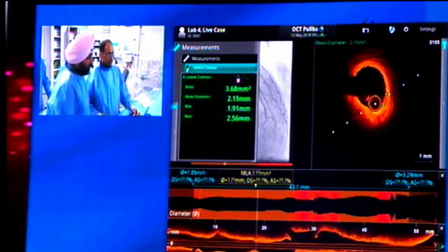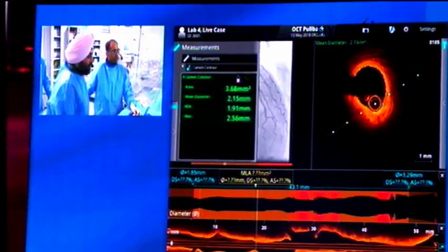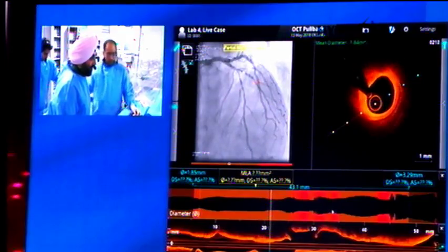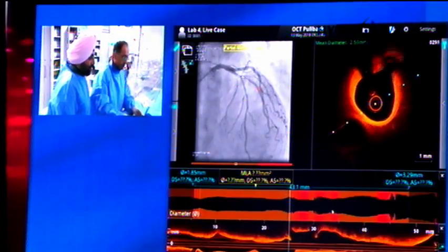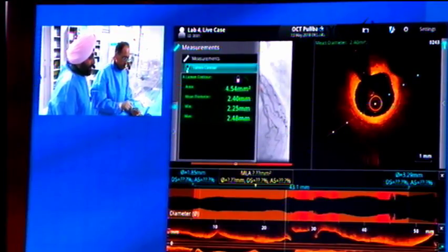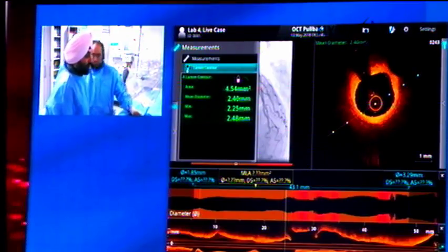So on the side branch, I don't think that's going to be anatomically significant. So I think the decision here not to proceed with a two-stent or bifurcation strategy was valid. And if we just keep coming here, we're coming up to the bifurcation there. So we're still in the ostium of the diagonal, and that's the ostium of the diagonal branch there. If we go there again, the MLA there is 4.54. So I think it's a very valid strategy here to go with a provisional treatment.